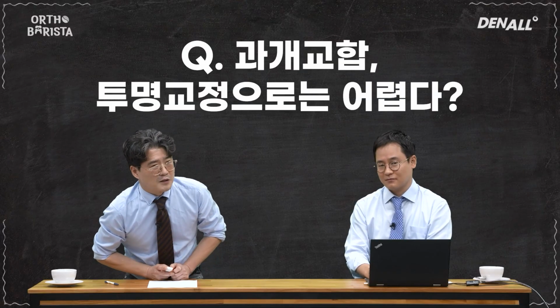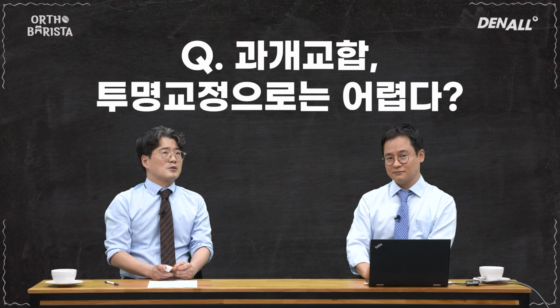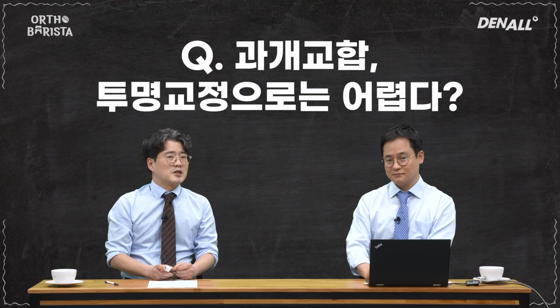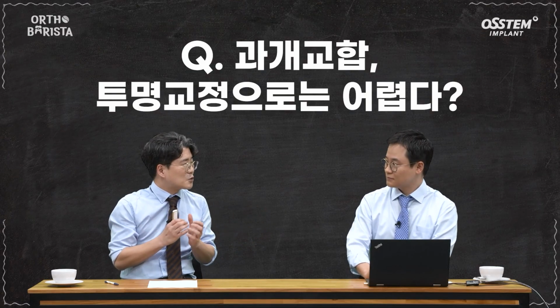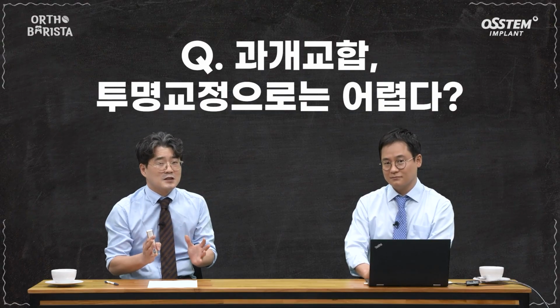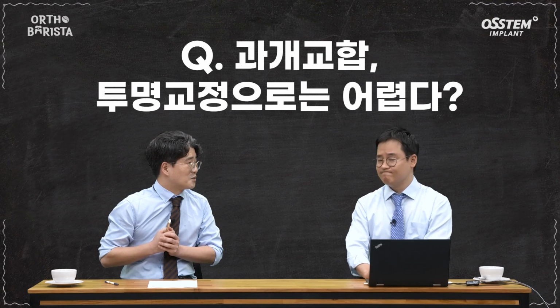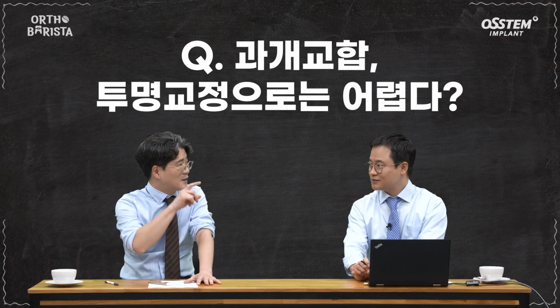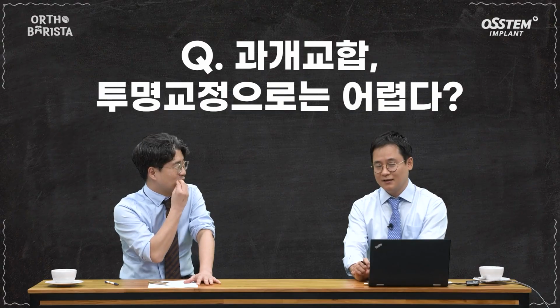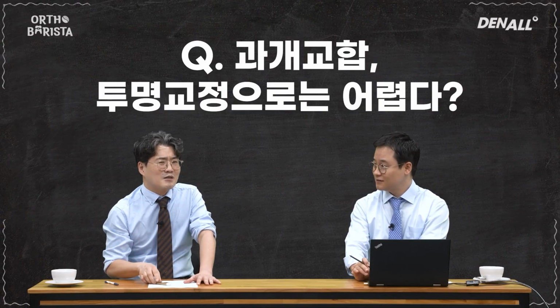Right. In fact, in that sense, we had been actually a little reluctant to apply clear aligners to a deep bite. But now it seems that paradigm has been shifting little by little from the early version. In particular, there have been advancements in material characteristics used in clear aligners, such as attachments. Do you remember that thing, Chewies from Company I? It is something to chew on. That was same with Korean manufacturers as well.